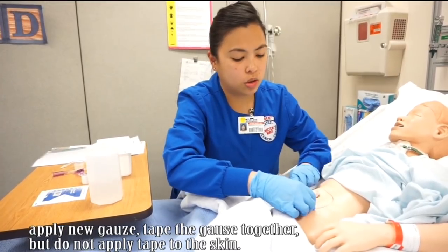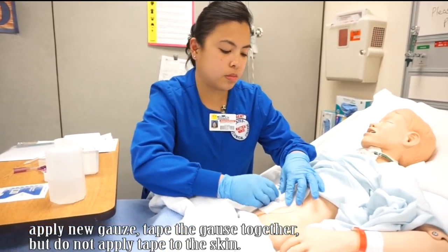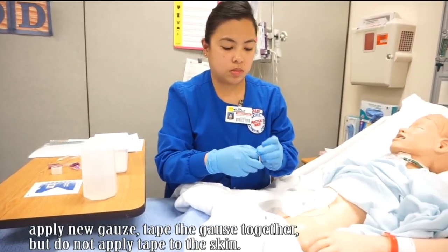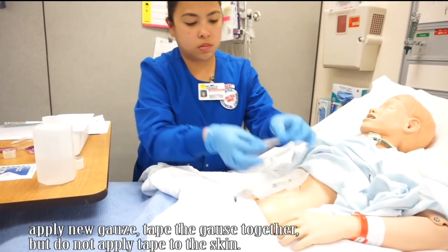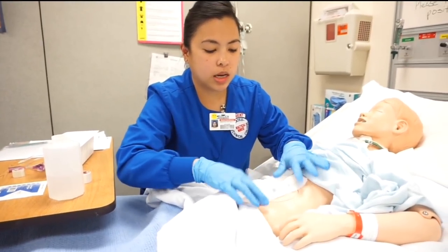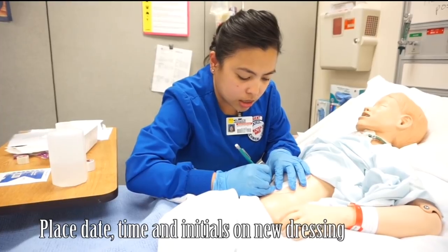I'm going to apply the dressing over here on the other side, making sure everything's okay and that I'm not irritating the site. I'm going to use this tape to tape it together, making sure it's secure. I don't need to tape it directly on the skin. I'm going to grab my pen, put my initials, and date it today.